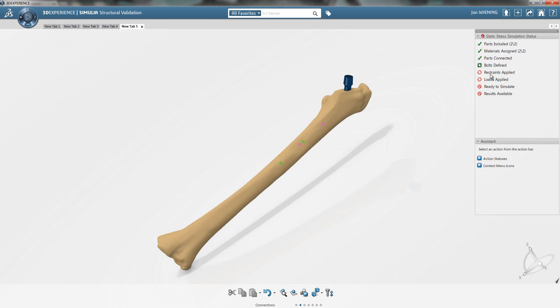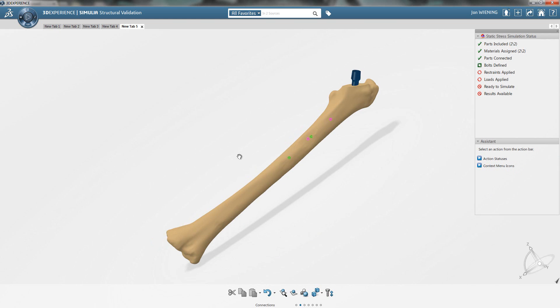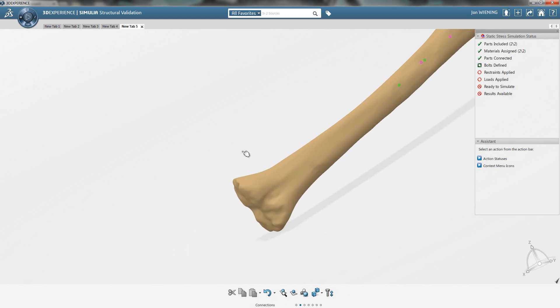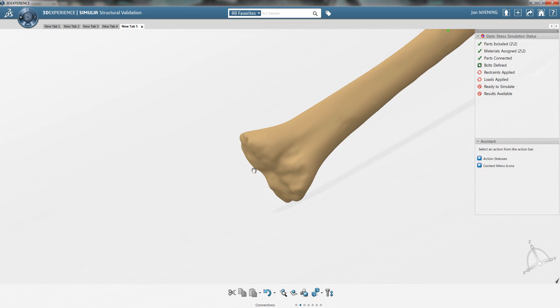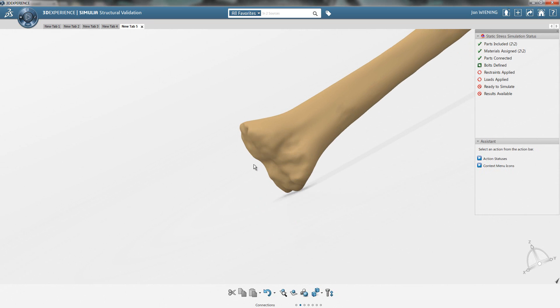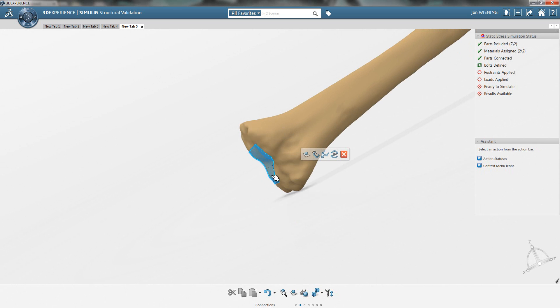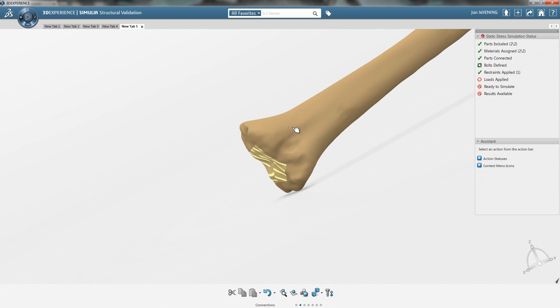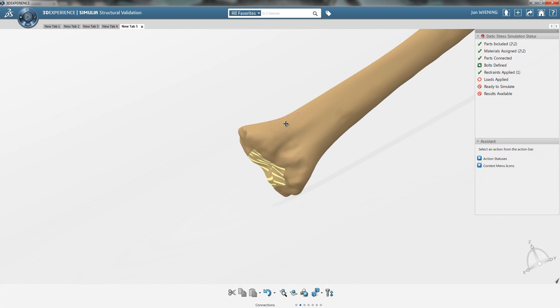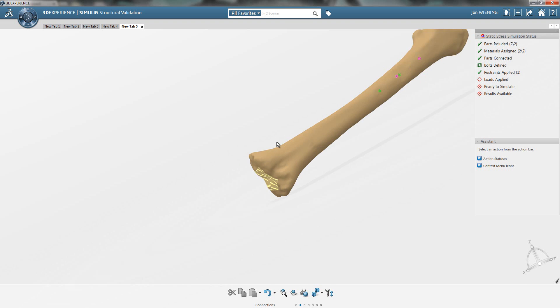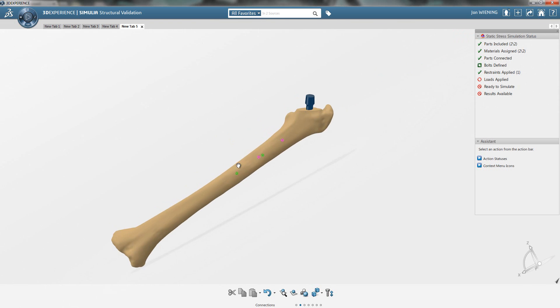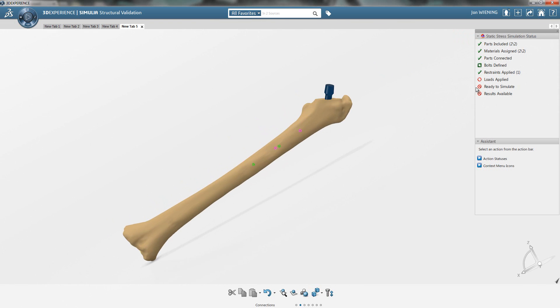I need to apply restraints. I just have a simple restraint that I need to define at the knee joint region. Let's select some surfaces here that I will clamp. We'll apply a clamp definition, and you can see that we now have the required restraints applied.